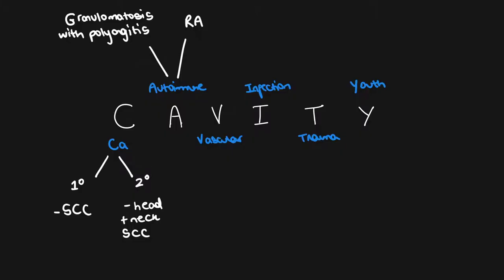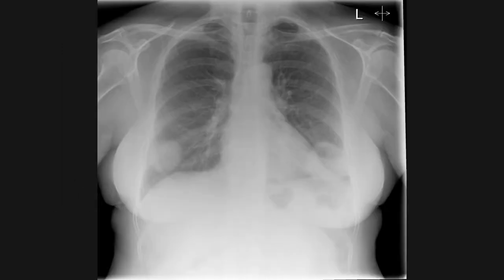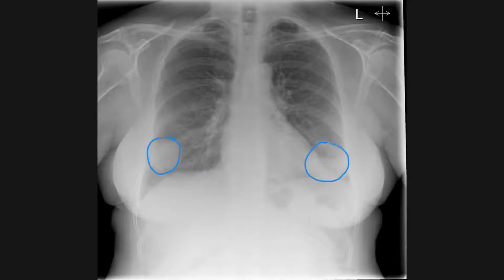Another important cause of cavitating lung lesions is autoimmune causes. This is usually granulomatosis with polyangiitis or rheumatoid nodules which have cavitated. On this frontal chest x-ray we can see two abnormal soft tissue lesions — one in the right lower zone and one in the left lower zone. The lesion in the left lower zone has gas density projected over it, which suggests that it is cavitating.